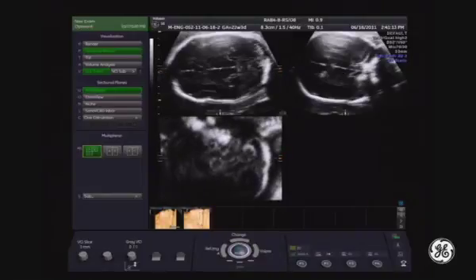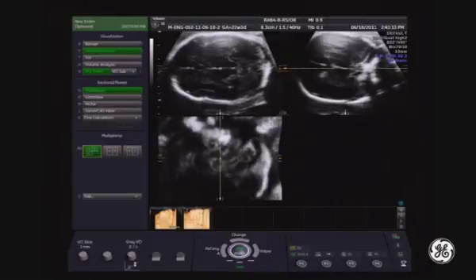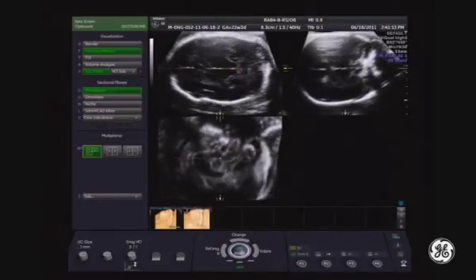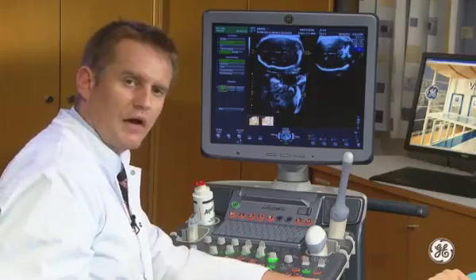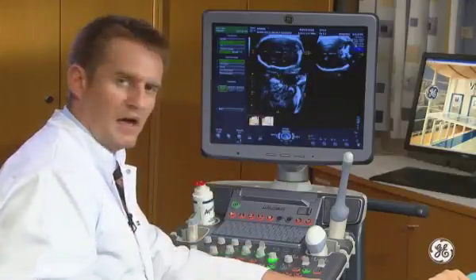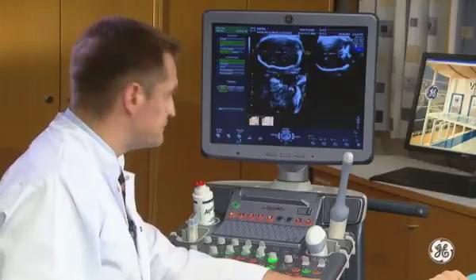I'm having the reference image A active. I do the Z rotation here, and I move to reference image B. I correct this, and the result comes in C. So this is our goal, where we use 3D for the brain in cases where we suspect midline problems or the anomalies of the cerebellum.